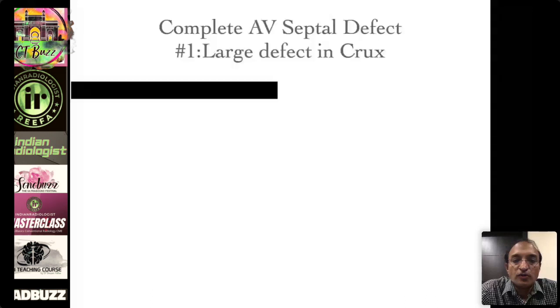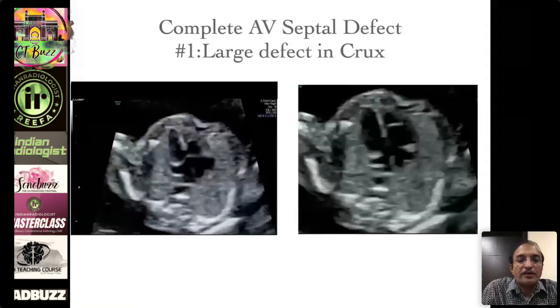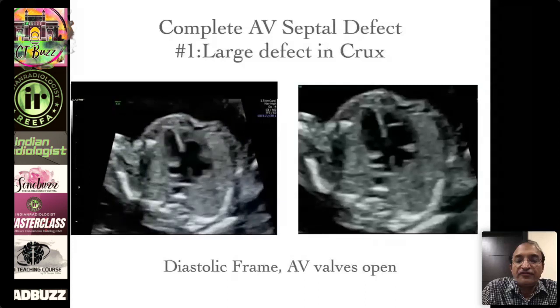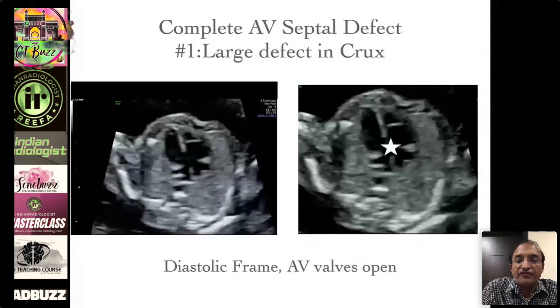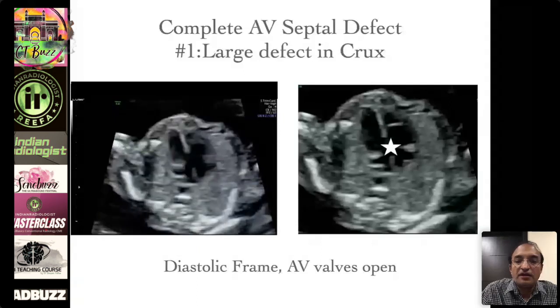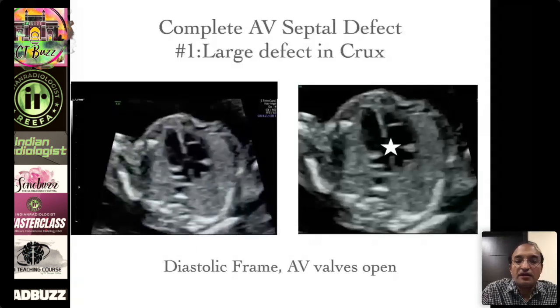Let us see what are the components of the complete AV septal defect. The first is that there is a large defect in the crux of the heart. This is a diastolic frame where the valves are open, and you see a large defect in the crux of the heart with the valves open. So that is the first clue.